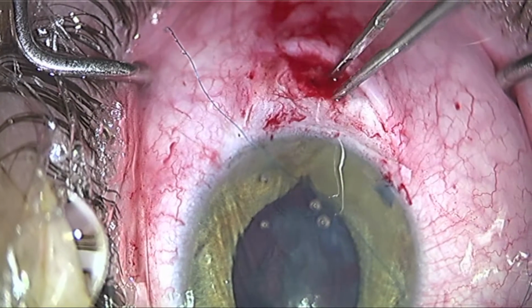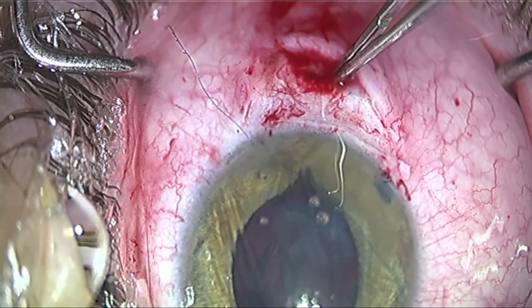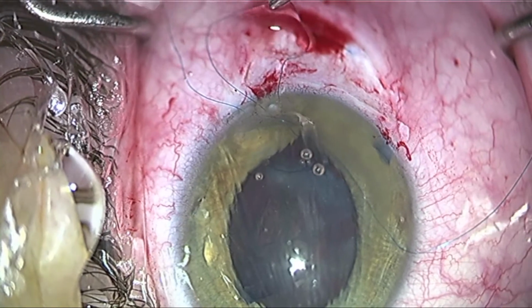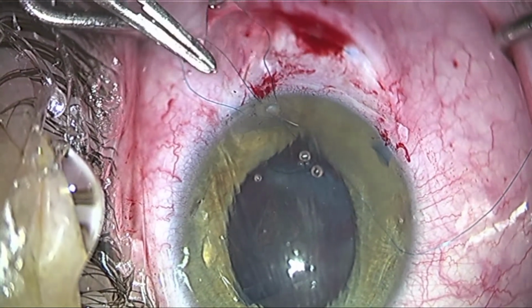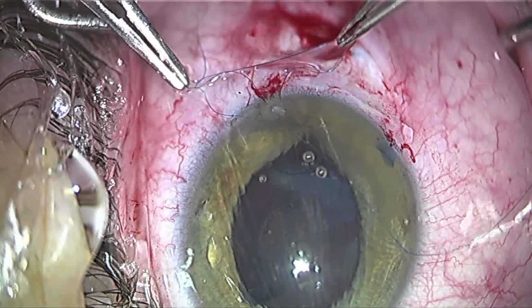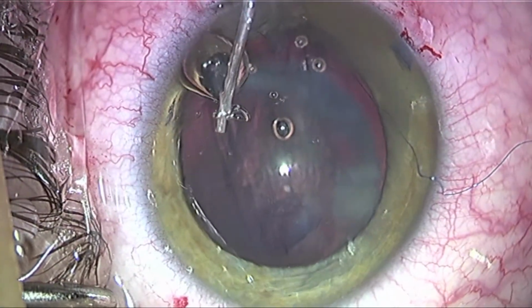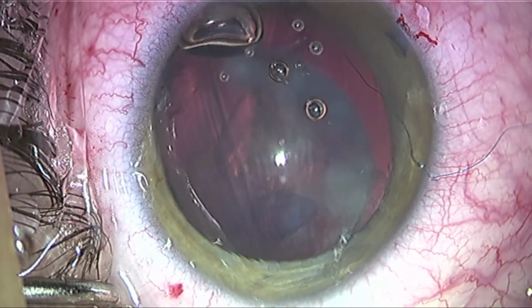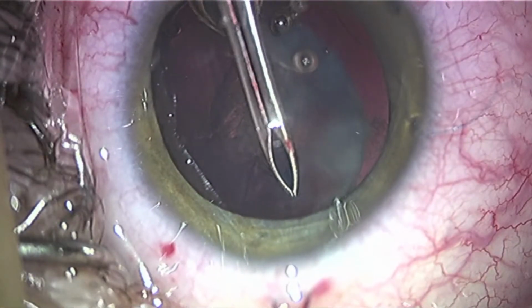You can pull on the piece of suture that's outside of the eye, and you can see that there's not really much room left to move the lens over. So then we just complete the Siepser internal knot with another few throws, and then place more viscoelastic in the eye. As you remember, we have to complete the capsulorhexis here.